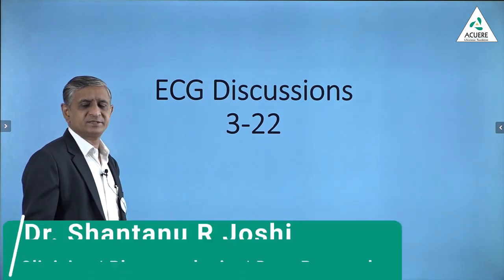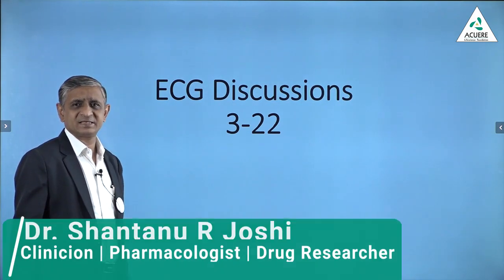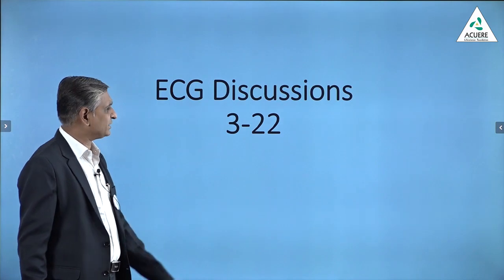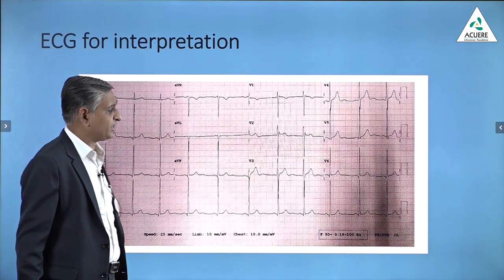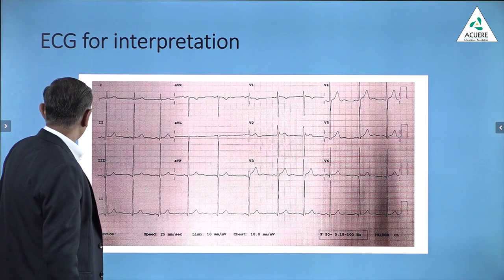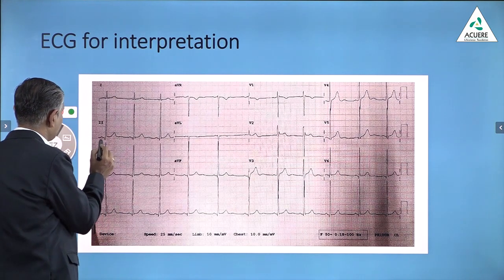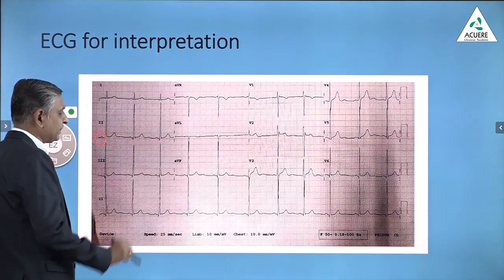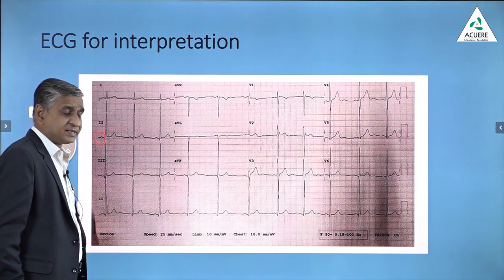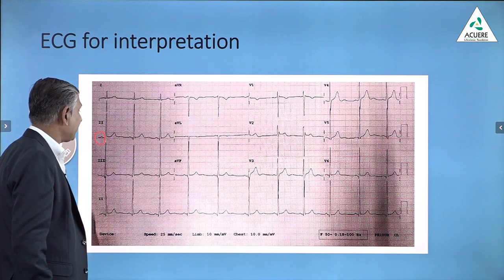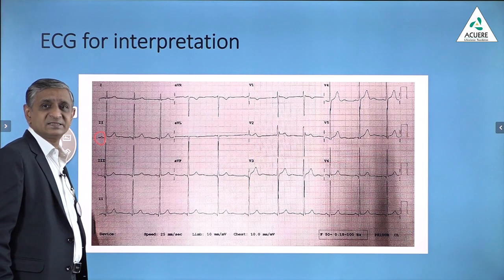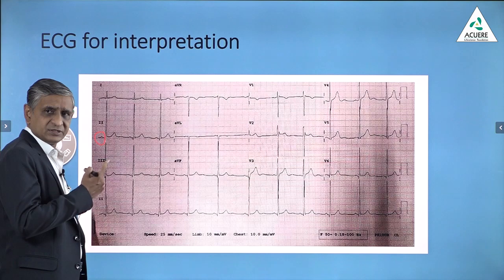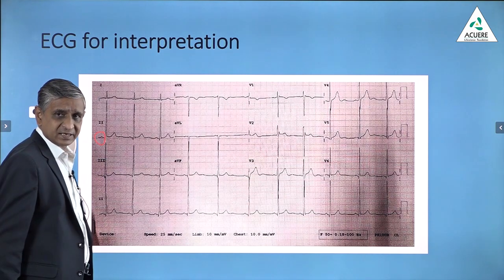Dear students, now we will discuss about a new ECG. This is the third ECG of 2022. As usual, you have to find out the P wave. One should find out the P wave properly in lead 2. And if it is present and normal, say that the heart is beating in sinus rhythm. In this ECG, the heart is beating in sinus rhythm.